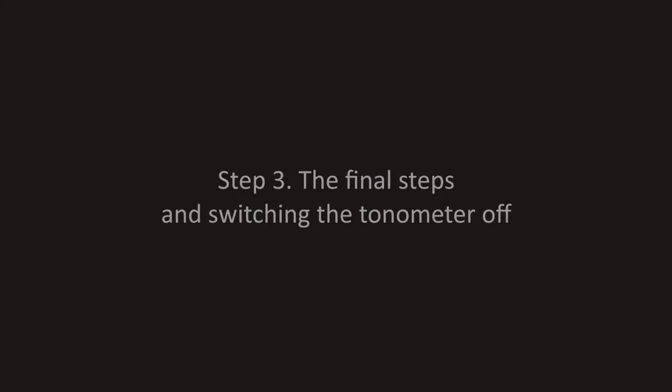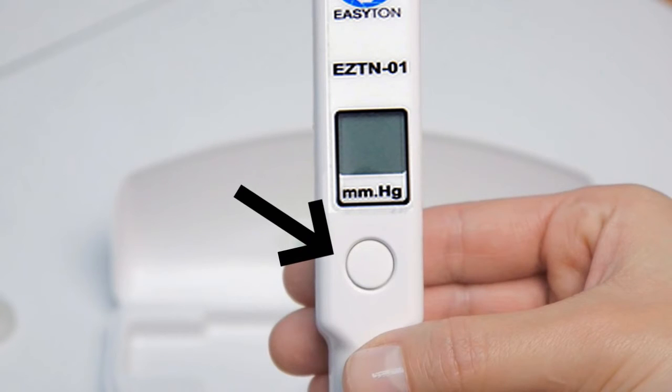The final steps and switching the tonometer off. Switch the device off by shortly pressing the button. Place the tonometer with the rod up and put the protective cap back on.